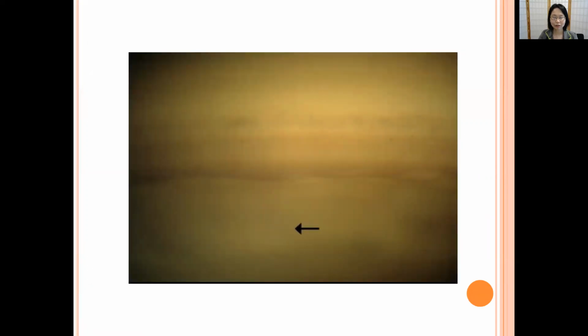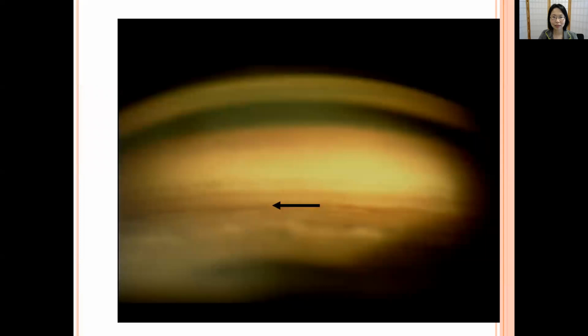And so think to yourself for a moment, what am I showing you with this arrow? And the answer here should be iris. And here you're seeing ciliary body band. Here you're seeing scleral spur. Here you're seeing trabecular meshwork. And here you're seeing either Schwalbe's line or cornea.